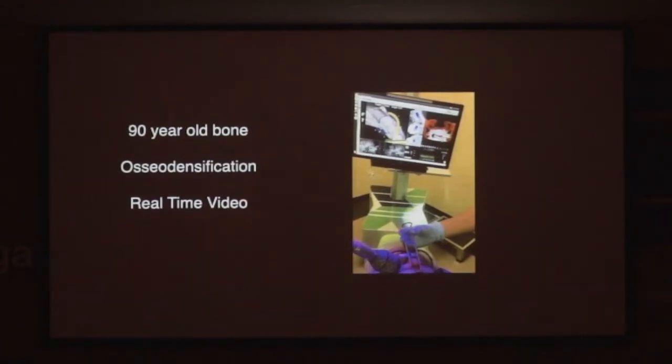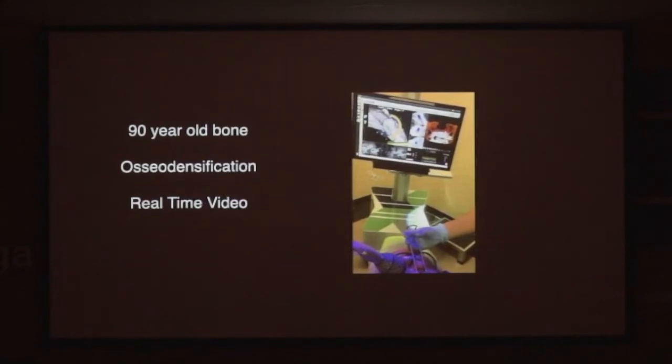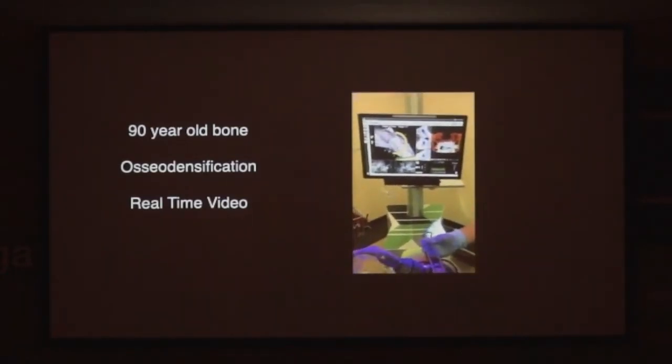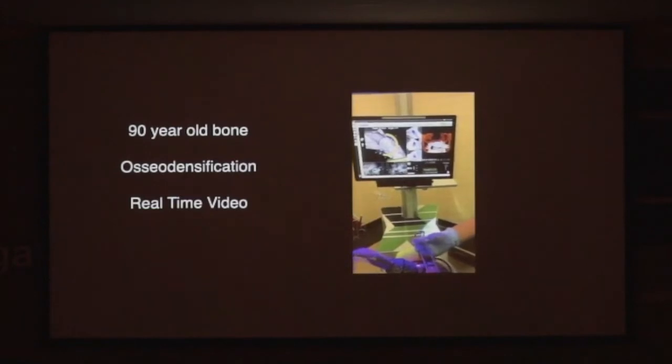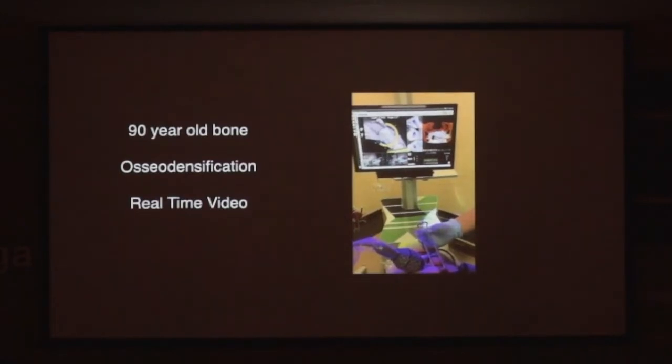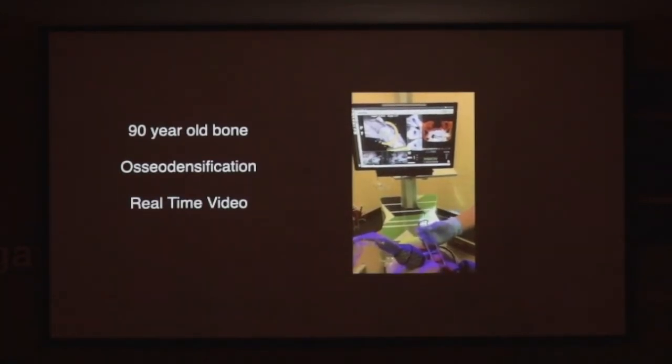So when you want to do immediate cases, you want good torque, and you don't want to waste bone. So this is a fantastic way to do an immediate extraction. Compressing it. This is an immediate extraction. I'm really densifying this, so I'm pumping this bone.